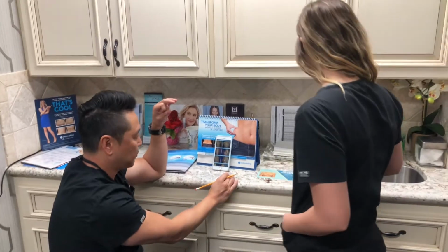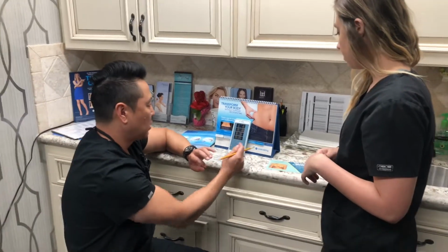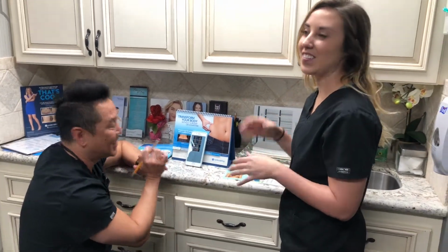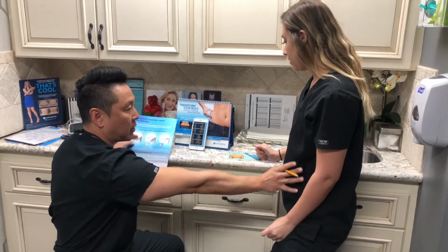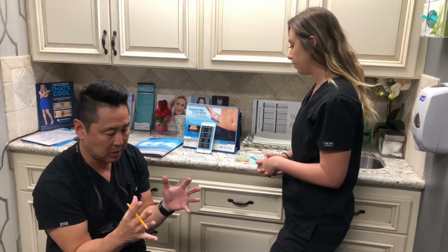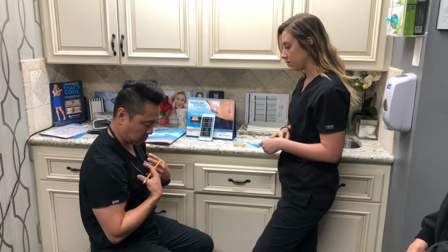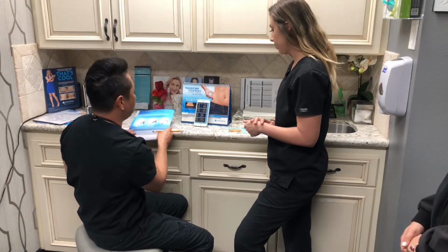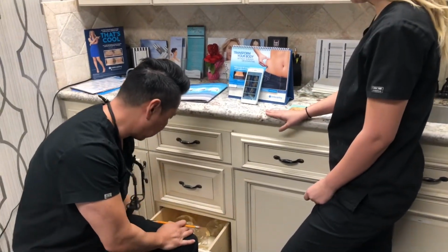One of the things that's always a journey is sizing, profile, etc. that all the patients want to go over. And it's really hard to find your twin. I think Krystle spent, I spent like 2 hours researching this. She's becoming a typical patient. We already kind of know what profile, because she's quite thin and she doesn't want that ball projection look, which is important in smaller and thin patients. We don't want to go with a super full profile. We want the profile and projection to be a little bit softer, so we are going with a moderate profile with her.